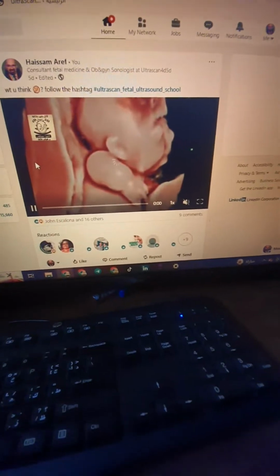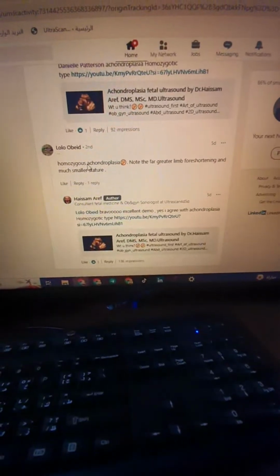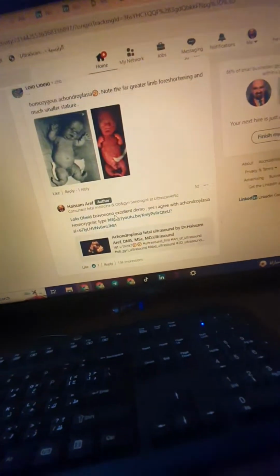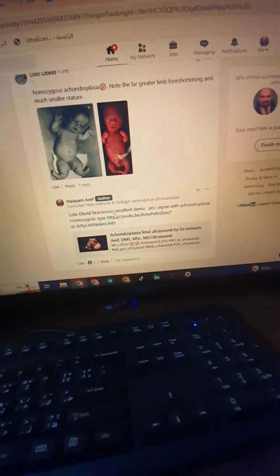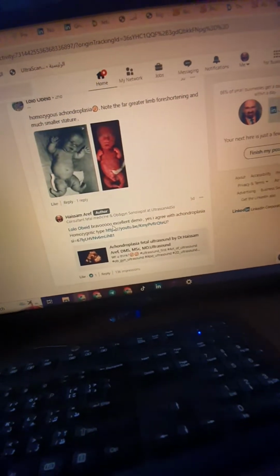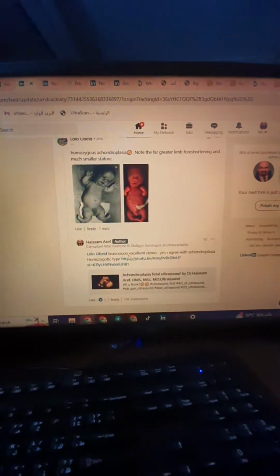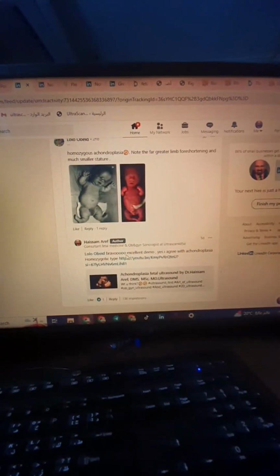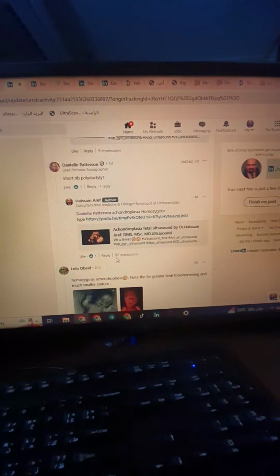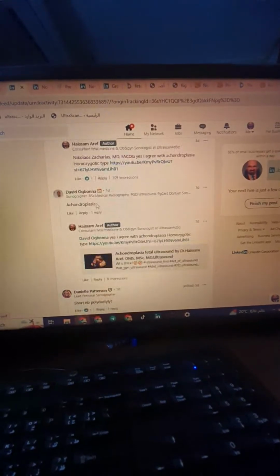Here we had a case, and I will go to the answer of Dr. Ala: homozygous achondroplasia. Yes, because if you search about achondroplasia, you know something called homozygous and heterozygous. The heterozygous is the one closer to rhizomelic dwarfism, but in the case of homozygous achondroplasia, it's fatal. There is far greater limb foreshortening and much smaller stature. So it's achondroplasia homozygotic type.